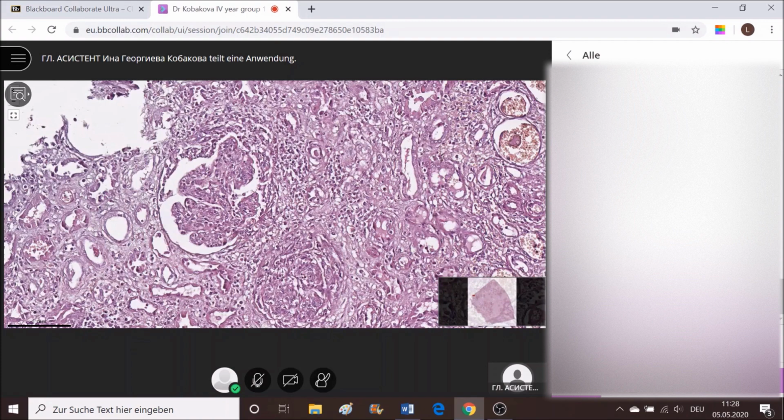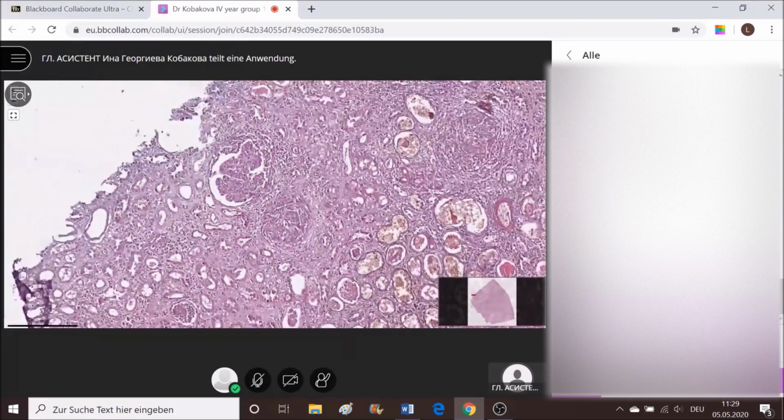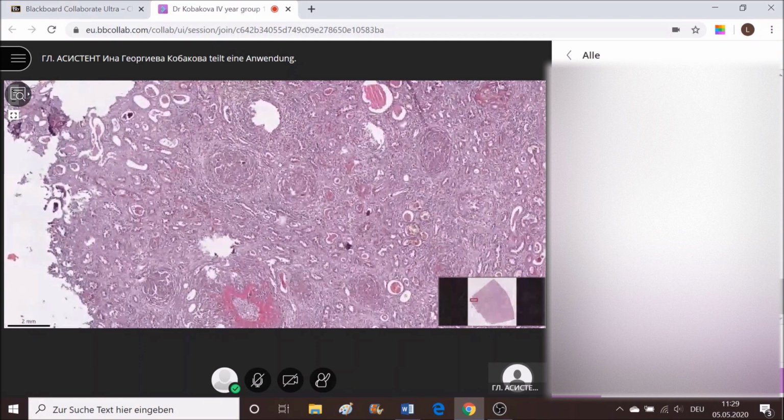So pretty much the process is starting here also, not so being spread inside in the glomerulus like all of the others, but yet appearing to be evident. So we will call this type of glomerulonephritis rapidly progressive glomerulonephritis, or crescent glomerulonephritis, if you will.